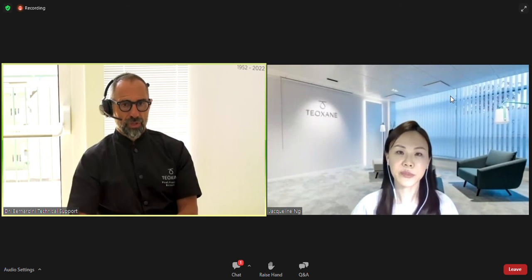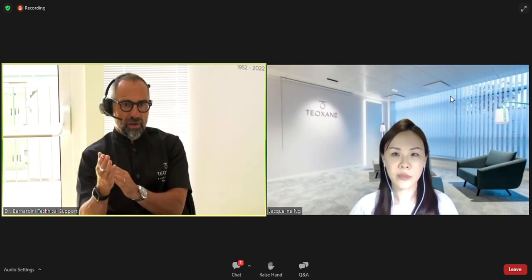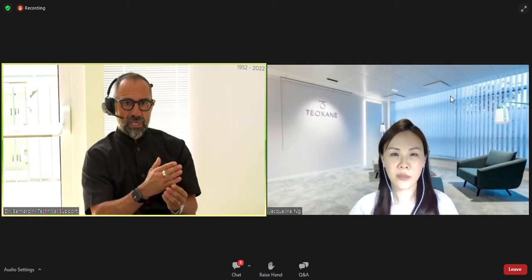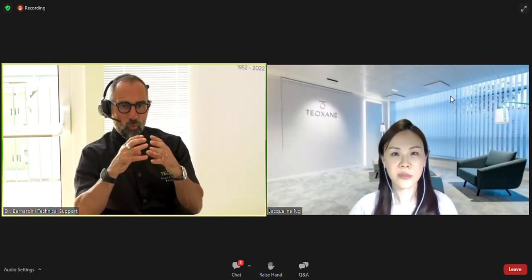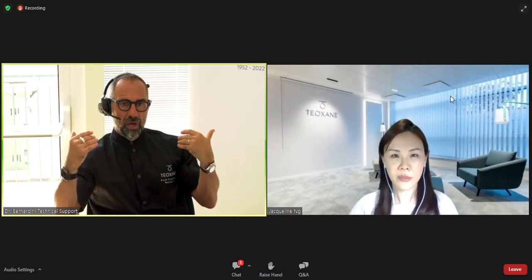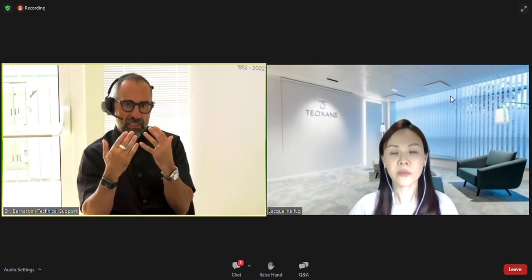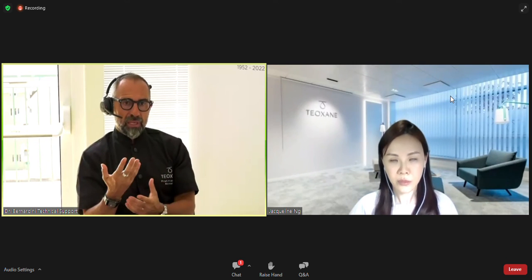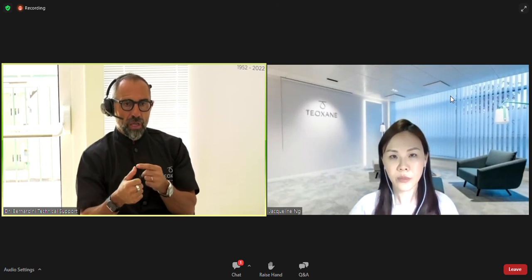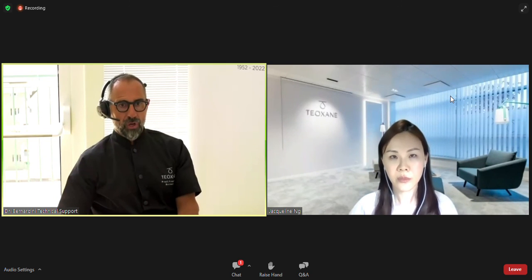So when you do this, you're using a little more than just one syringe of filler, half on one side, half on the other, but you're addressing more. You have a wider view of the defect. It's not the tear trough, it's what I refer to as the eye-cheek junction. That is in my mind the dark circle. The dark circle is a big definition. It's not just the color. It's the full circle of the orbital malar hollow.